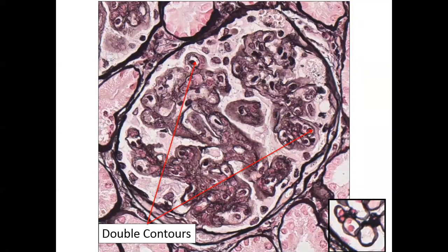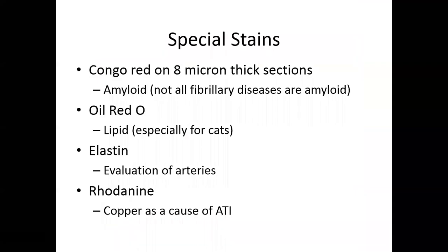Okay? Any questions about the stains that I just talked about, the trichrome, PAS, or Jones? Anybody need to unmute themselves? I'm going to look at participants. Everybody's good? Oh, we have a lot of people attending. That's exciting.